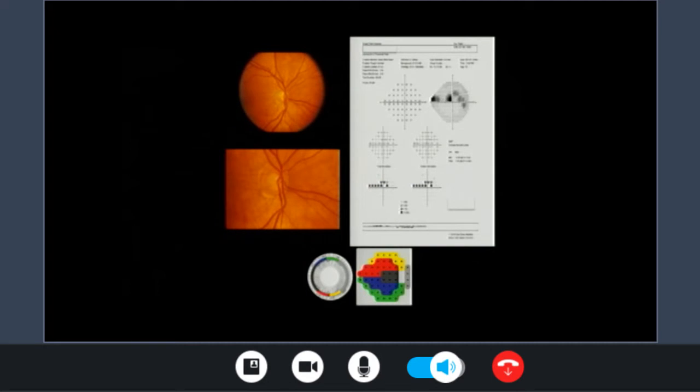Glaucoma. Once you go here for your disc photo, look at the superior rim and inferior rim. What kind of thinning is the patient having, and in which area? Inferior. Inferior changes will produce changes in the reddish and yellowish zone, which corresponds to the superior area. So now the patient has started to develop these changes. In future, these changes might progress more and more because the thinning is inferior, right? That tells you that if you don't act fast, the patient might come with full involvement of this superior zone. So he might have a dense superior scotoma.